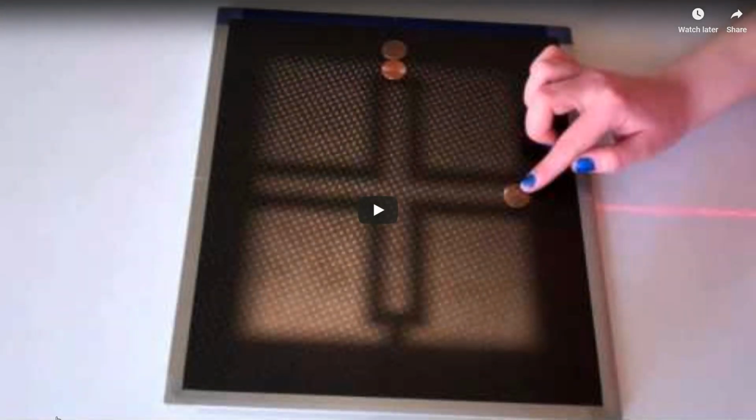So the idea, I wish this would have continued, is that you process this, right? And you can tell if you're getting a penny that's outside of the light field at any one part, then your collimator could be off. And then it's our responsibility to not wait and not say anything, because that's going to affect you and that's going to affect everyone. And it's also a problem that could potentially get worse as you go on. So that is what is happening with collimation.